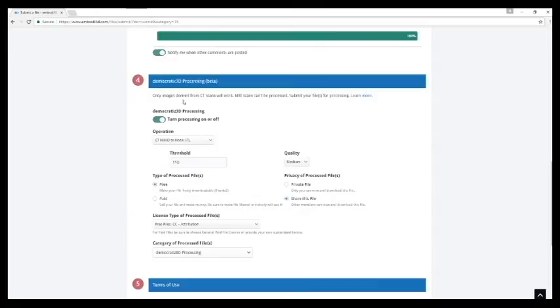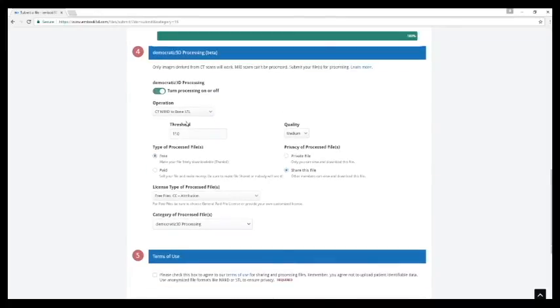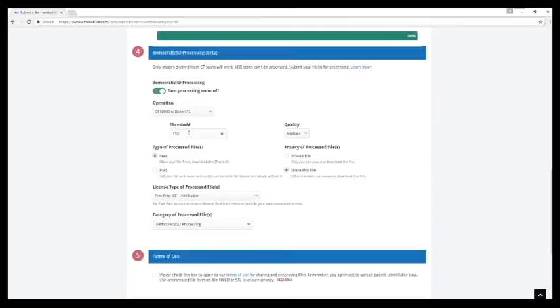So here you'll want to make sure that the democratize 3D processing is on and we are converting the CT NRRD to an STL file. This is really important here. We will want to increase the threshold or the Hounsfield to take away some of the bone and leave us with a working file for when we digitally extract it. I typically found that anywhere between 900 and 1050 really works. I will go ahead and start with 950.